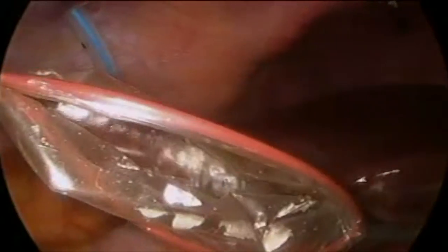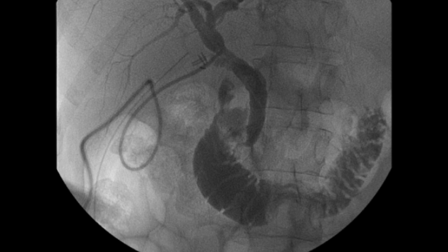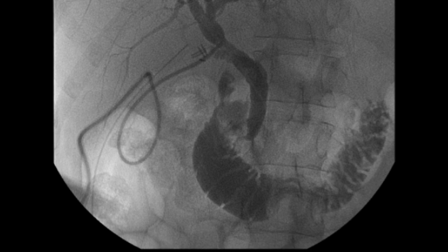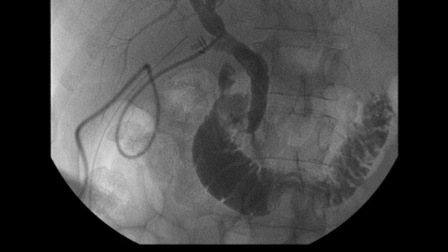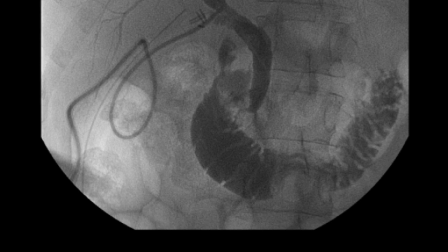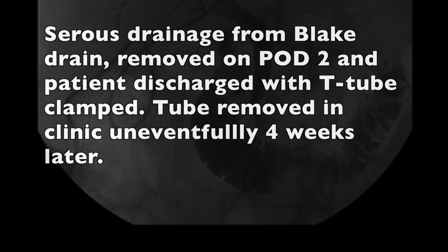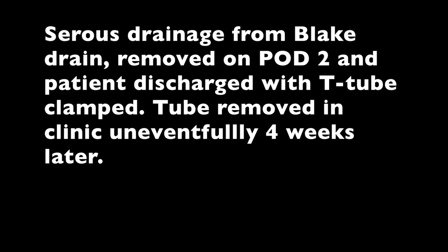Post-operatively, a cholangiogram was done through the T-tube showing filling of the intrahepatic ducts, no filling defects, and filling of the duodenum. The T-tube was clamped on the same day and the drain was removed. The patient's T-tube has been subsequently removed in the clinic uneventfully.